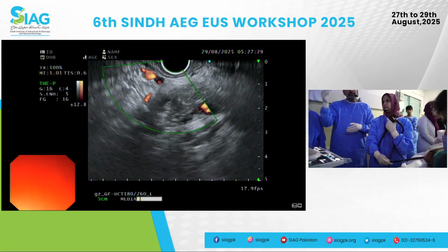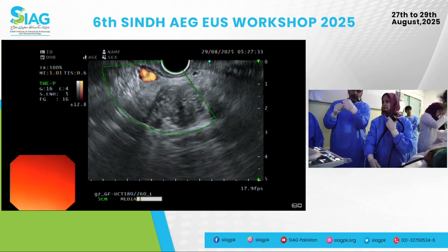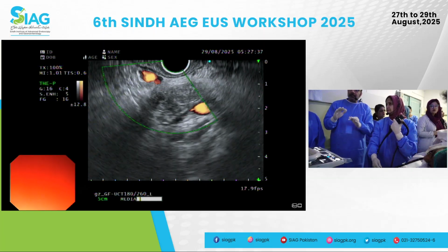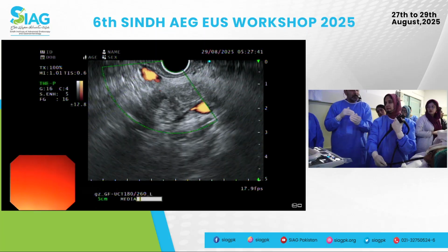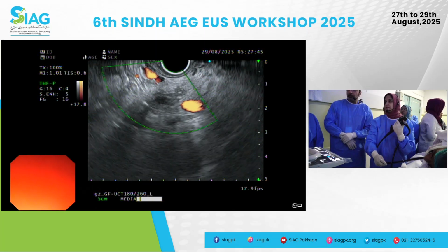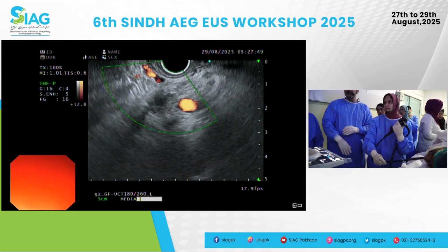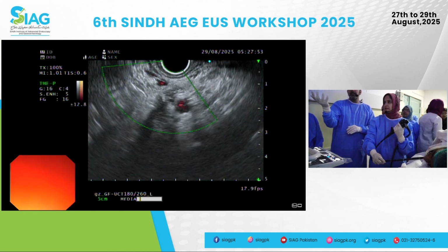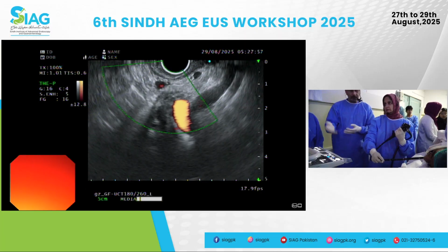All right. So even on the CT, you will see a lot of collaterals, and sometimes you'll see the fullness in the fundus, and that's your varices. But they're the same thing. The definition is based on the location, intraluminal versus extraluminal. So what you're seeing are not varices necessarily. You're seeing collaterals. But this is also a good time when you see that to consider doing a retroflexion endoscopically to see whether or not you see varices as well.